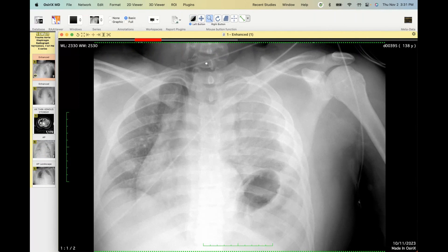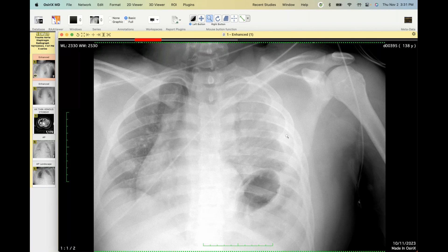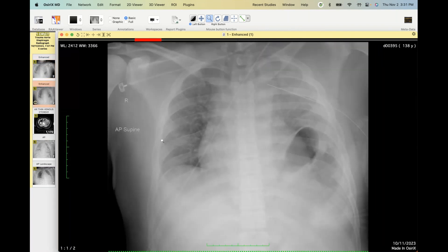This next case is quite a trauma case. This patient shows all the hallmark findings of traumatic aortic injury — the trachea is pushed halfway into the right hemithorax, loss of the aortic arch contour, the left main stem bronchus is depressed, no discernible anatomy other than a huge mediastinal hematoma and probable hemothorax. The stomach bubble is higher on the right than the diaphragm, suggesting a diaphragmatic rupture component.